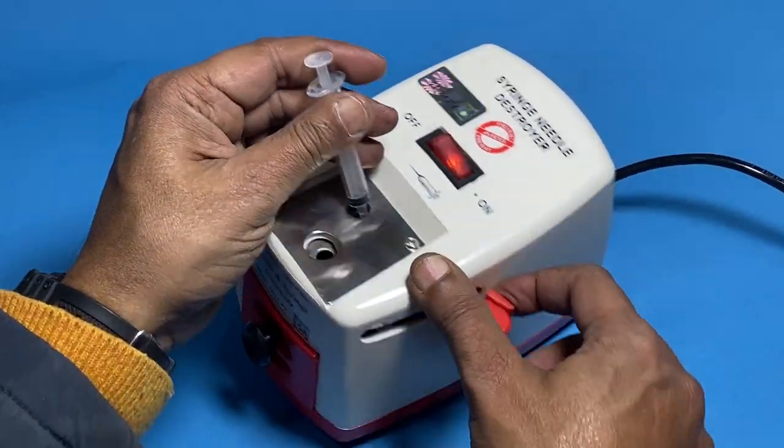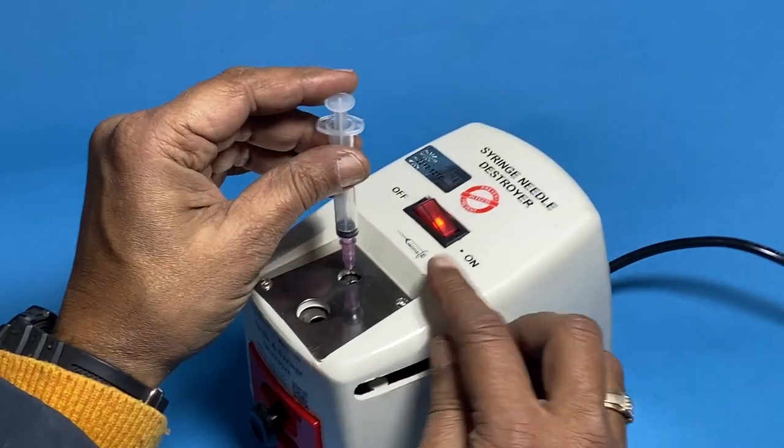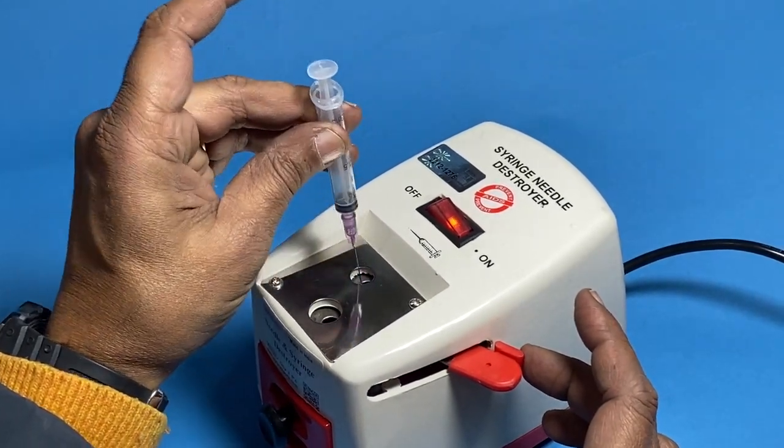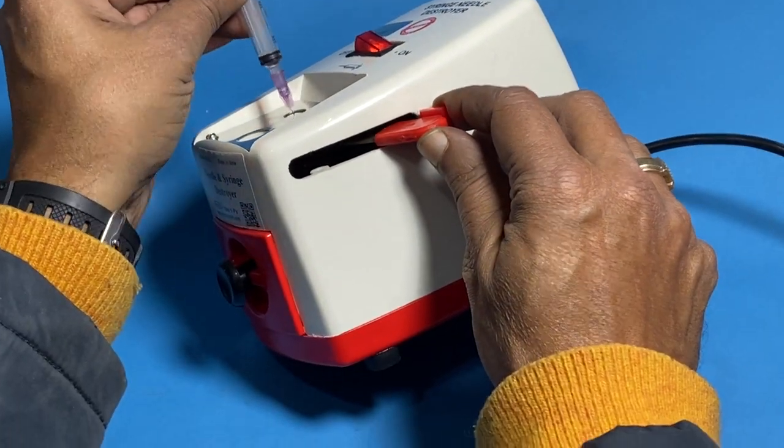Yeh bahut aasan hai. Yeh sirf cutting karne ke liye use hota hai, aur yeh needle burn karne ke liye hoti hai. Jab hum isko burn karenge — yaha se dekho, sparking aa rhi hai yaha se aur burning hoti hai yeh peh.